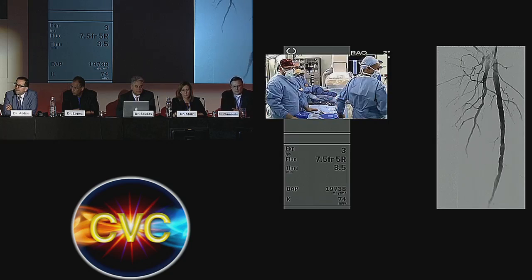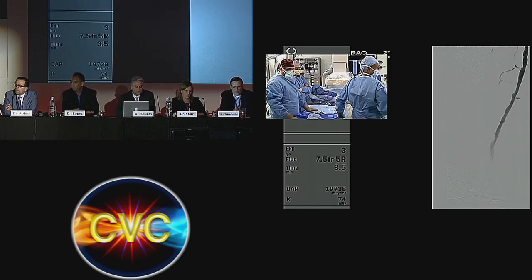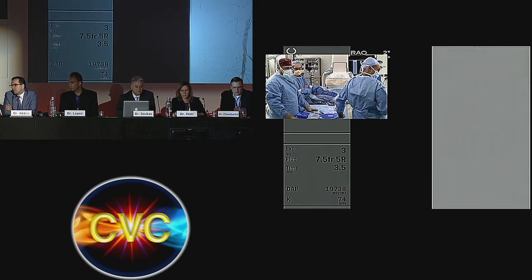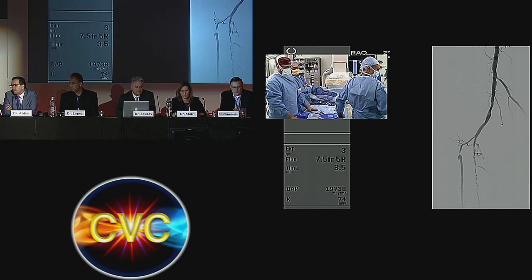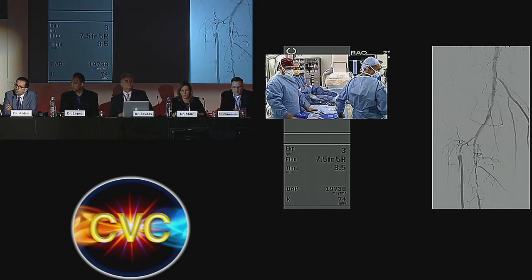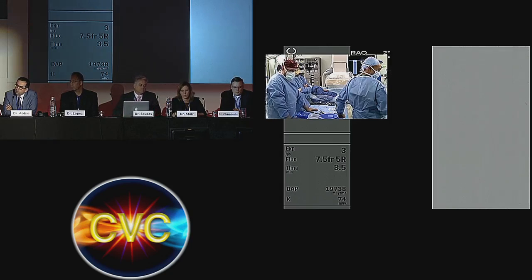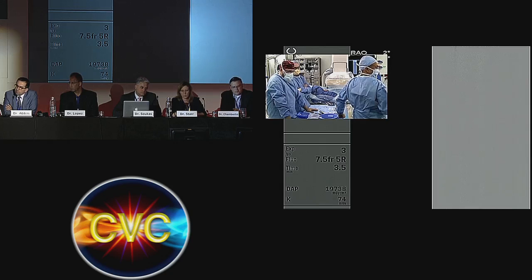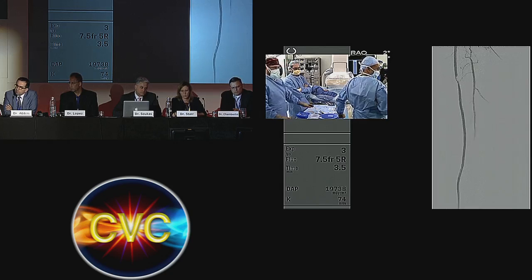The next one, Ed. That's more of that distal, more diseased area with some collaterals that show you that there is something going on hemodynamically. And then next one, please, Ed. You see how there is also some tightness regarding the popliteal, and then a fairly tight subtotal, also proximal anterior tibial artery. Pretty much the only vessel that goes down to the foot. Keep going. There's then an anterior tibial tight lesion right there. And then the rest of the AT actually looks fairly benign.